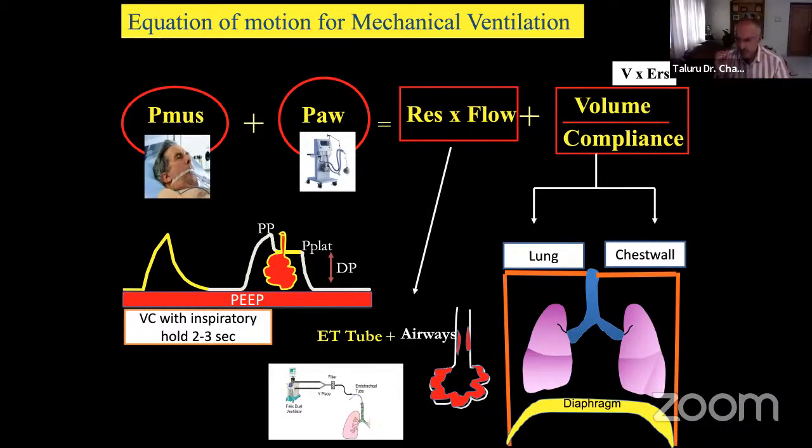Whenever you start with a tidal volume of 6 to 8 ml, then you give a PEEP of 5, an I:E ratio of 1 is to 2, because the guidelines don't give clarity there. Rate of around somewhere between 12 to 18 should be okay. Then a FiO2 of less than 40%. Then the first pressure you see is PIP.